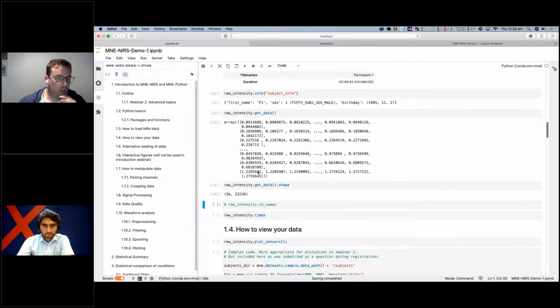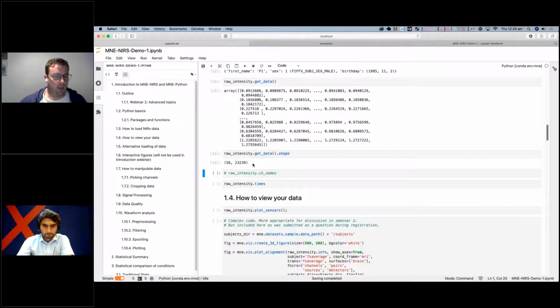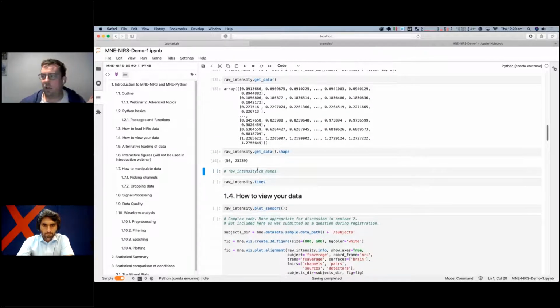So how do we use that? How do we go forward? We had a couple of questions before when people registered. A few people asked about 3D locations and positions. I'll show that in a second, but it's a more advanced topic, so I won't go into details, but we'll touch on that.